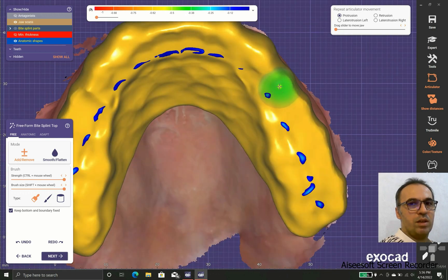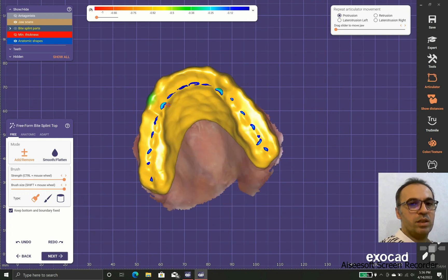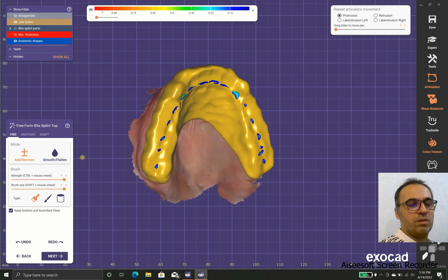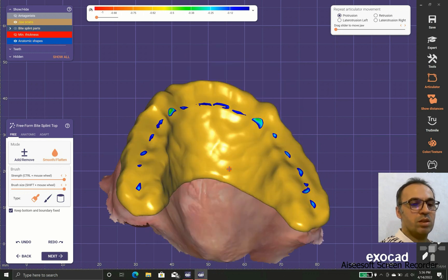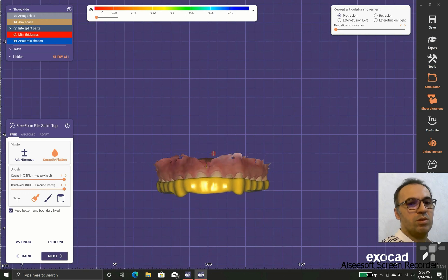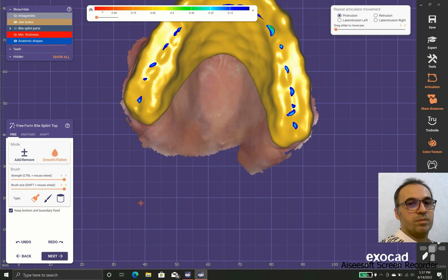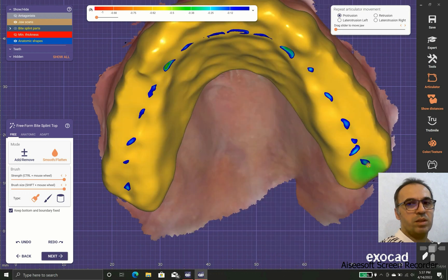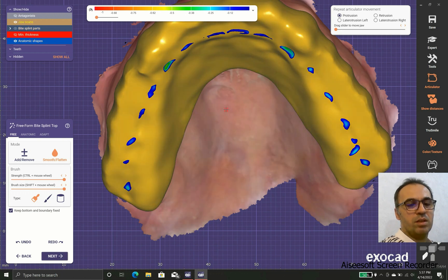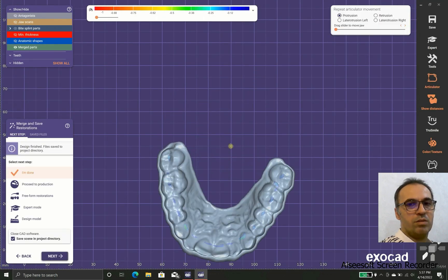We should have a little more length on the canine contacts to ensure the canines do not let the posterior teeth interfere with anterior disclusion — that is one of our goals. The other goal is to have canine guidance providing disclusion of the posterior teeth. It is also better to smooth the inner part because it may be irritating for some patients, and it lets patients tolerate the splint better.